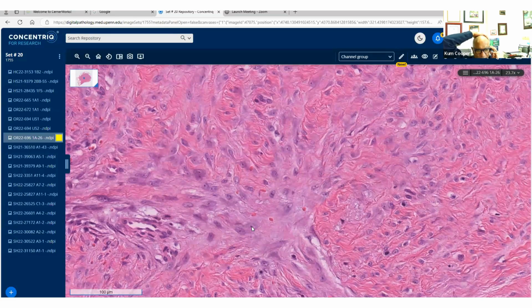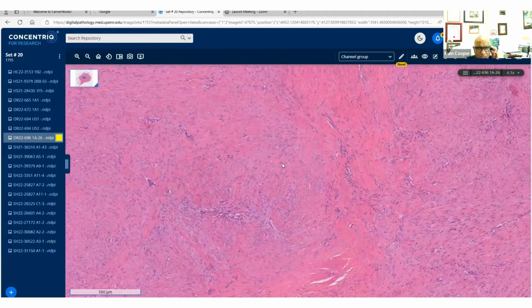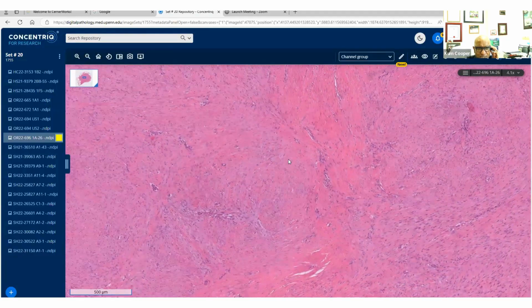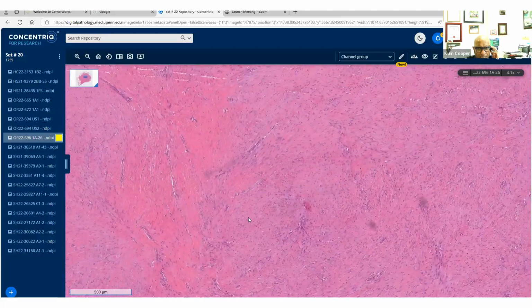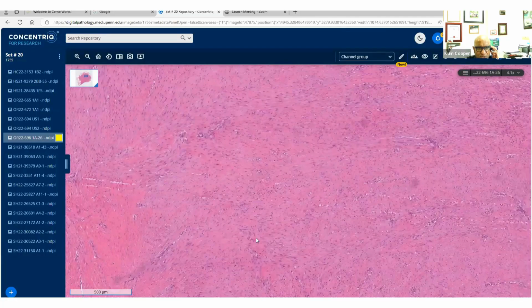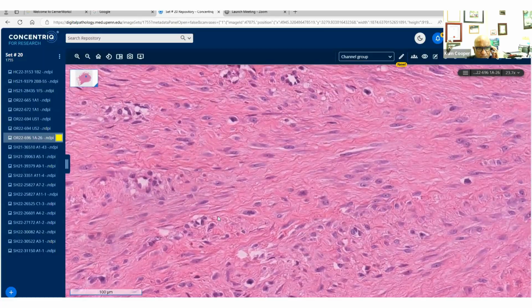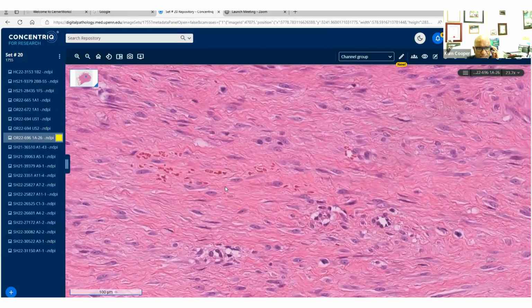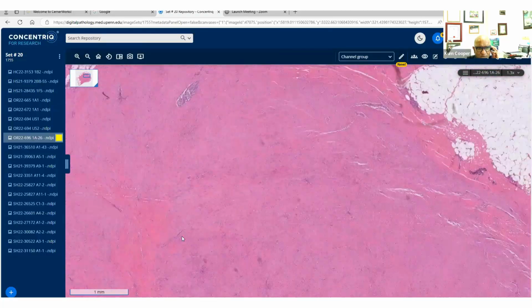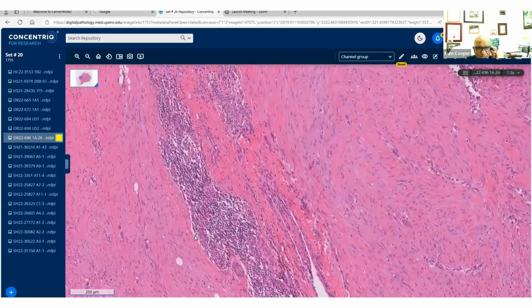Go for history, go for location, size. This is 1.6 centimeters. This is, like Dr. Who mentioned, a classic fibromatosis. I would not be concerned about nodular fasciitis here. But I brought that in just to have that conversation, that in needle core biopsies, I always look here, you even have a little bit of extravasation of blood. And on the other side, I said ignore it, but you even have some mononuclear cells, which, as you know, you can get in nodular fasciitis as well.